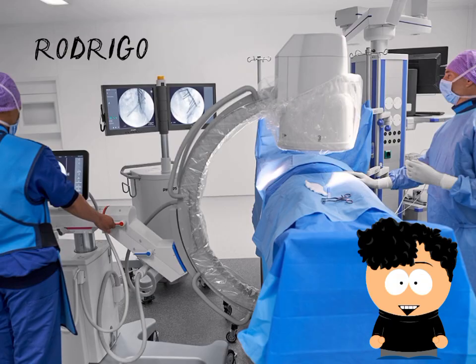C-arm equipment. C-arm equipment is a type of medical imaging system that uses X-rays to obtain real-time images of the human body. This equipment is especially useful in surgical and interventional procedures, as it allows doctors to visualize the area of interest with precision. Components of the equipment.